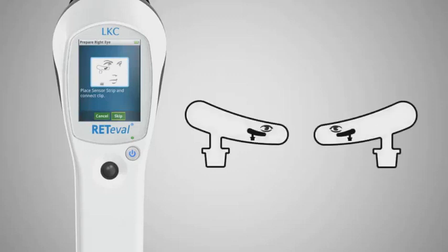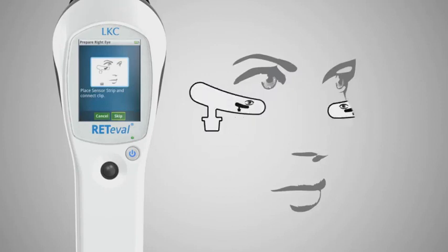The self-adhering sensor strips are designed for proper location and orientation. Place one below each eye.